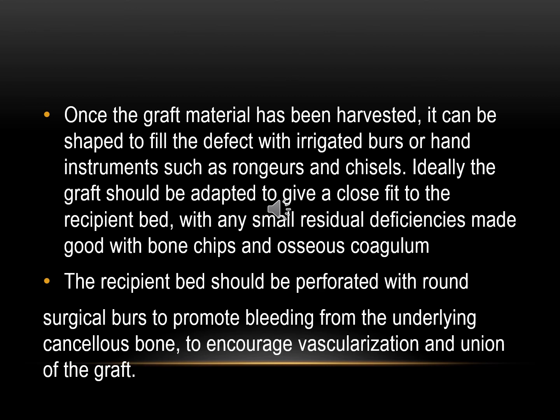The bone block must be cut to have good adaptation to the recipient bed. The recipient bed should be perforated with round surgical burrs to promote bleeding from the underlying cancellous bone, to encourage vascularization and union of the bone graft.